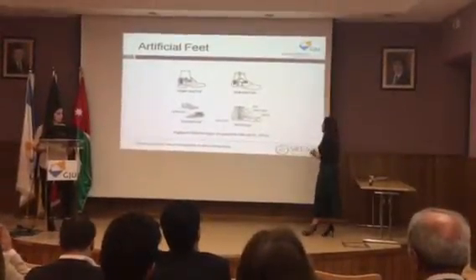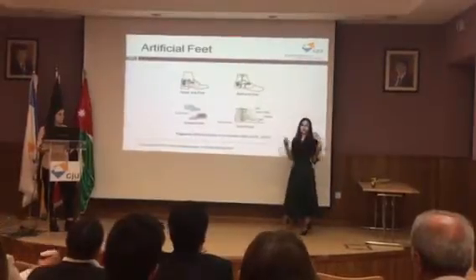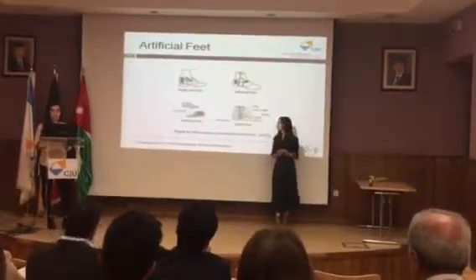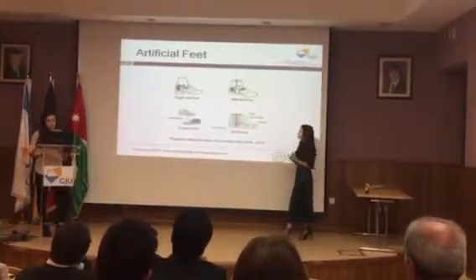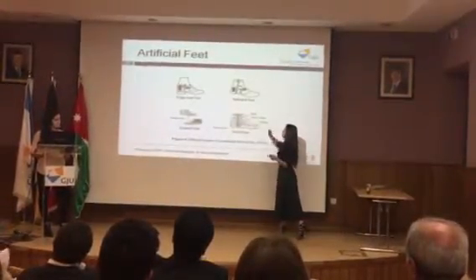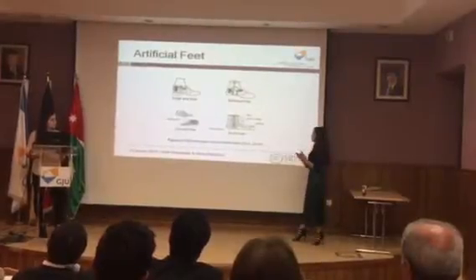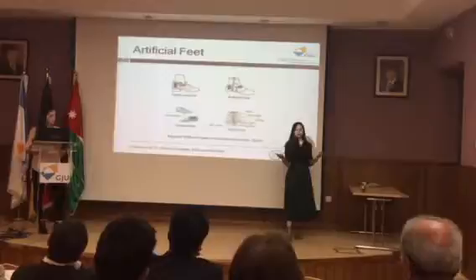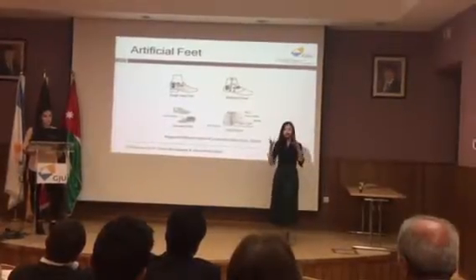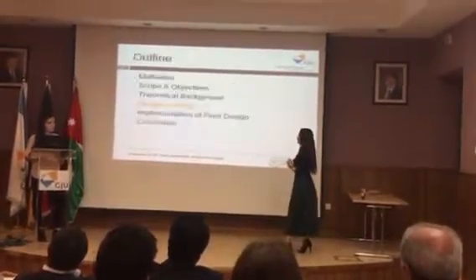The last foot here is a SACH foot, a well-known commercial foot, and it's known for its good price. It's very economical, and it has a heel cushion, which allows for a comfortable heel strike, in addition to providing a stable mid stance.